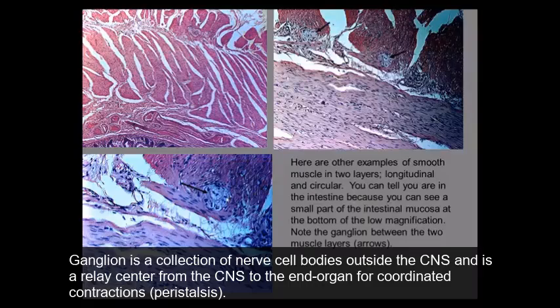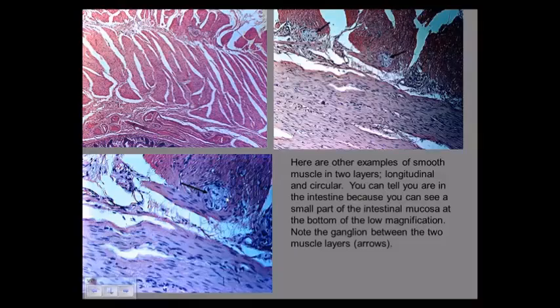What is the definition of ganglion? That's a ganglion. The definition of a ganglion is a collection of nerve cell bodies outside the central nervous system. That right there is a ganglion. This is a ganglion. So they're sending axons out to the smooth muscle so it can coordinate peristalsis. Okay? Artifact relating to muscle? It's everywhere. Every tissue is going to have some.